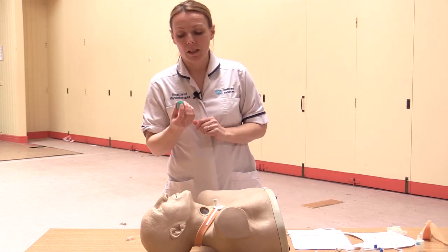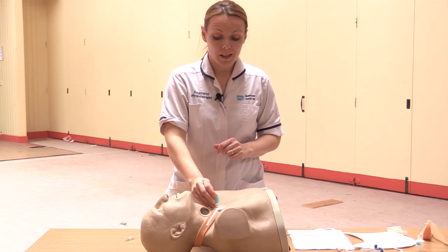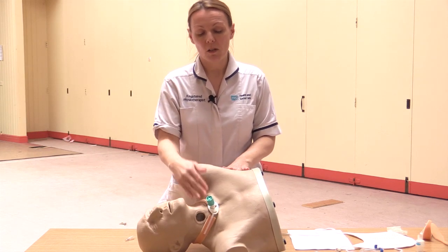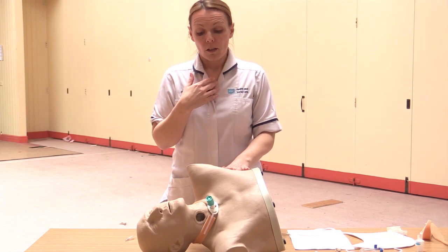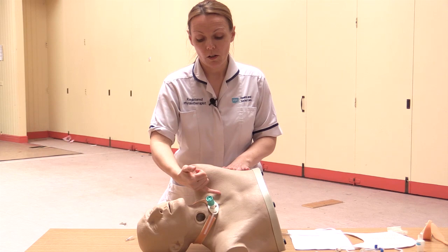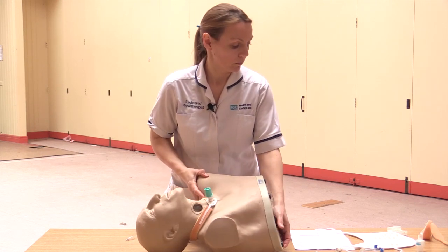And the other thing that you might see in the community is these wee Passy-Muir valves. That is a speech valve. The patient has a fenestrated tube, or a non-fenestrated tube, that allows the air to come up through the Passy-Muir valve and will allow some speech.